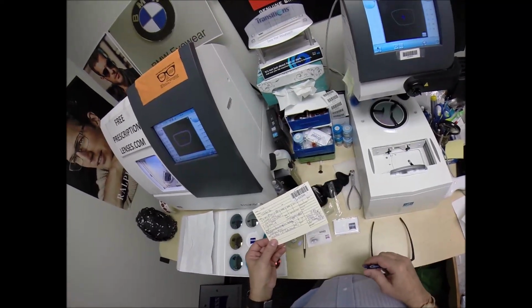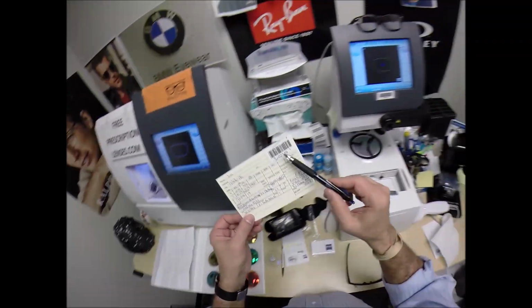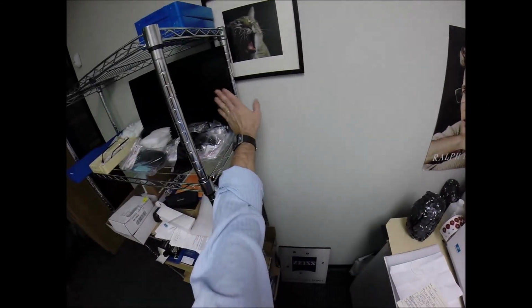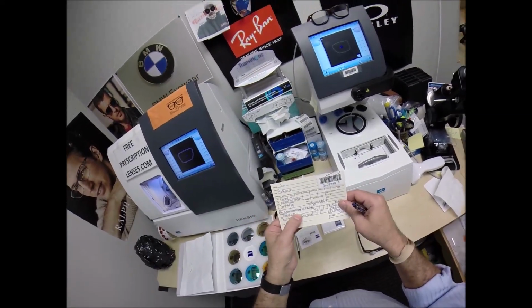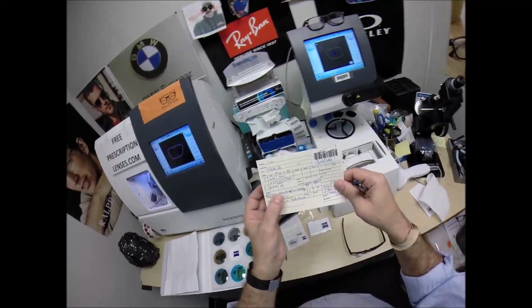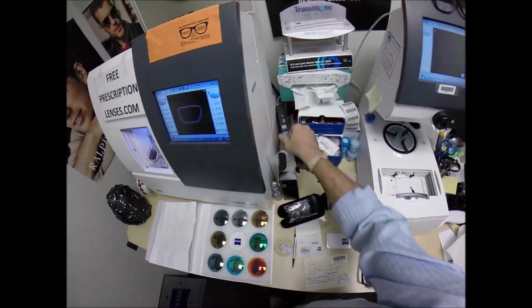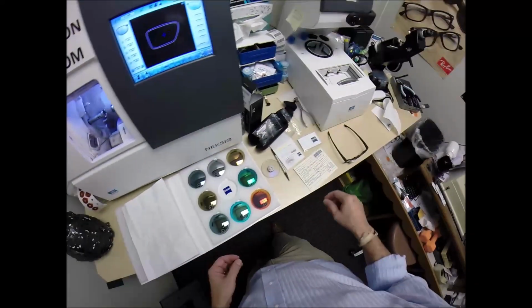In America it's another $400 to $500, but it goes literally unlimited, over 1 million. I'm at 2,349. This will go over 1 million in storage. You can pull it up. I've got to install my computer where I can do all that if you want to. You can put the patient's name, the frame information. It will store the PD, the seg height, the lens material, the frame, whether it's metal, plastic, or grooved. It stores all that. And it's amazing that this is a home computer now with how large they used to be, the towers. And now it does all that.